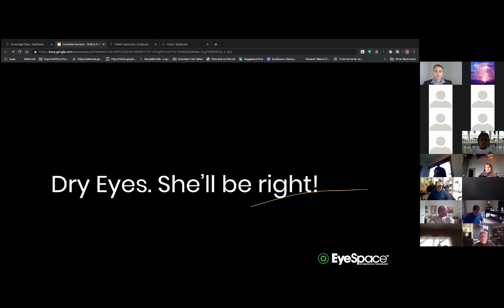replacing a lens. So I really let the mold or the reshaping lens do its job. It's that old adage that lawyers say, you've just got to hurry up and wait, because you go, oh, I just want to change something, but many times you don't. And obviously with software-based designs or even really good empirical fitting, 9 times out of 10, the fit on day 1 improves by day 14. So that's the approach I'd look at: not too loose, not too tight.